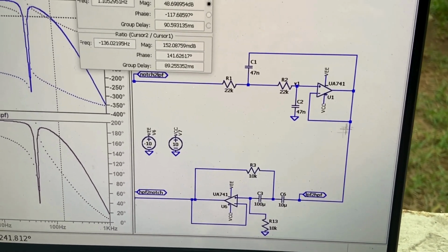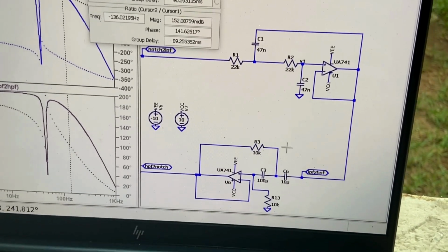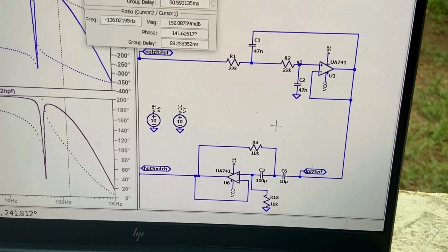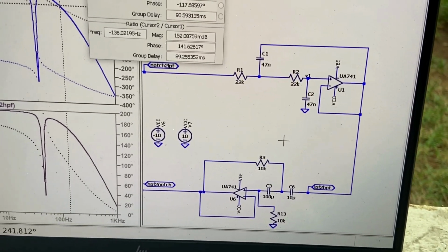Then we have the active second order high pass filter. The high pass filter has a cutoff frequency of 0.5 Hertz, ideally DC, because we want to eliminate all the DC noises in this particular case.